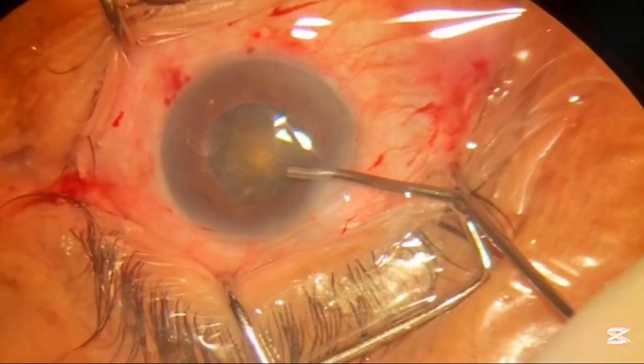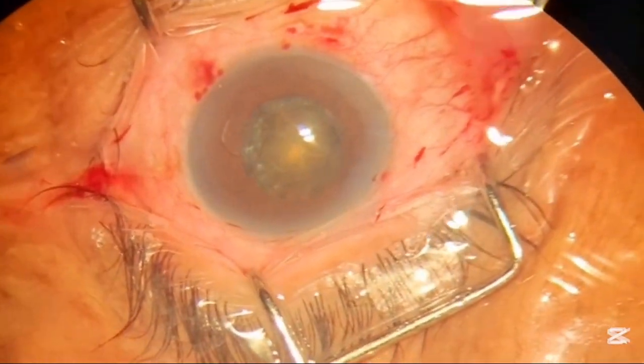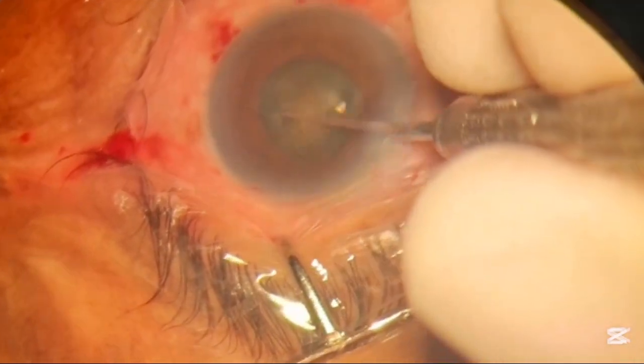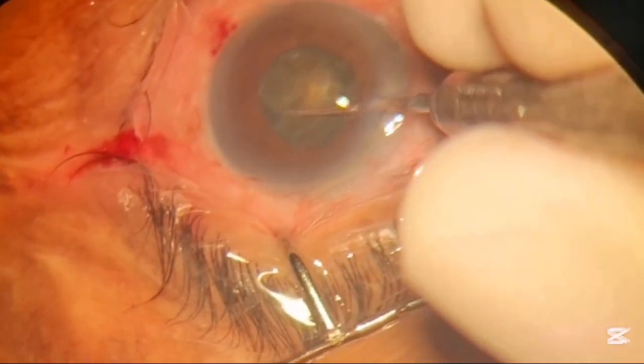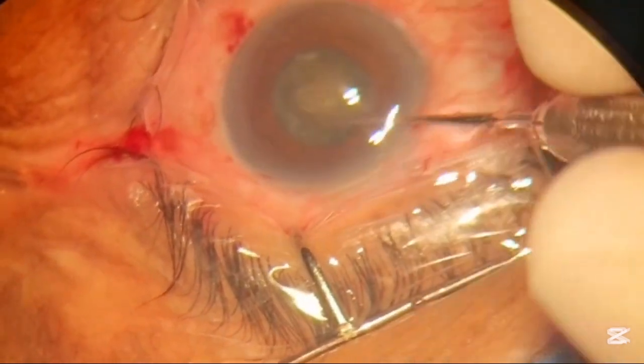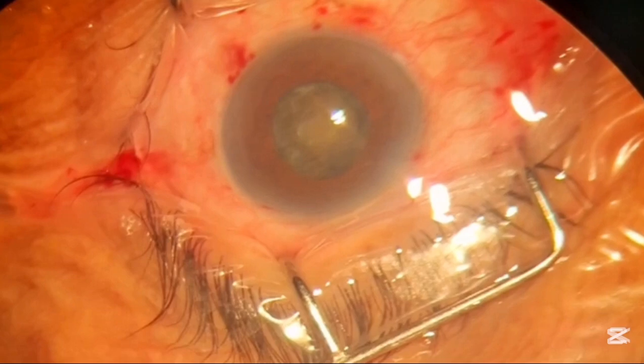Now after performing the capsulorexis we will perform the hydrodissection and dialing of the nucleus. We just have to gradually tilt the nucleus or displace it from its original position.